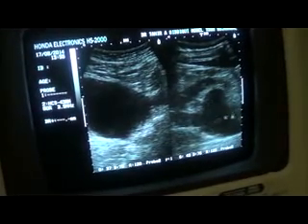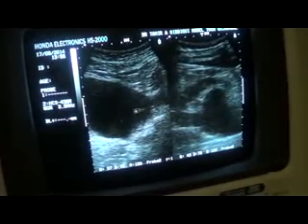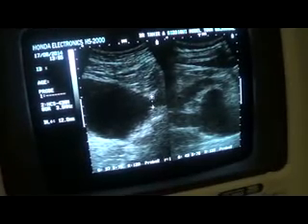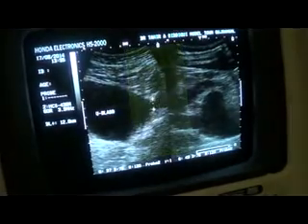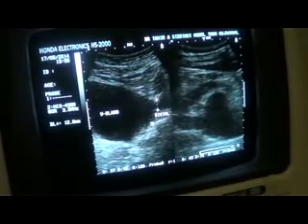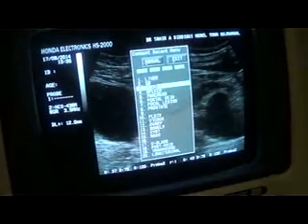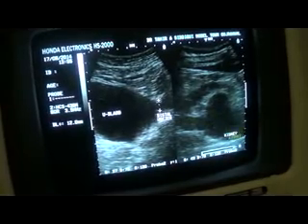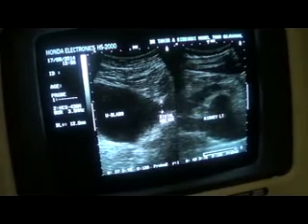Now you see, this is the left ureter, this is the dilated pelvis, rest all is normal, calyces are dilated, and this is the distal ureter that is entering the urinary bladder at a location which is an ectopic location. This is the urinary bladder. This is the distal ureter. And this is the kidney, left kidney, dilated calyces, dilated pelvis, and this is the proximal ureter. So this is the kidney on the left side. I'm showing you.